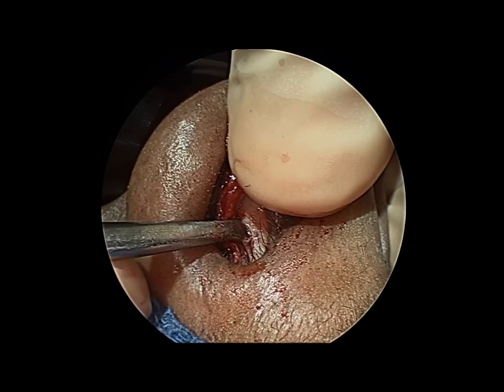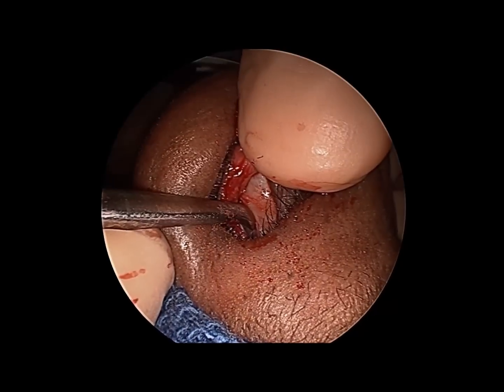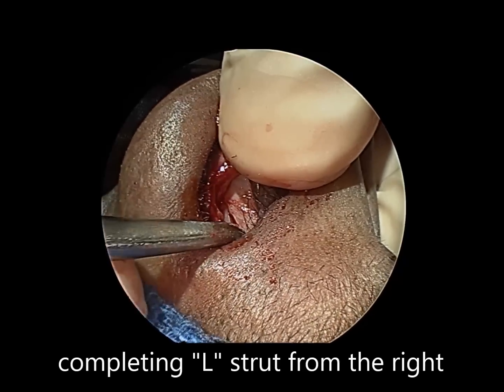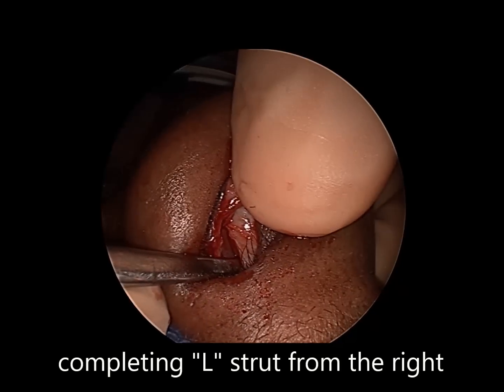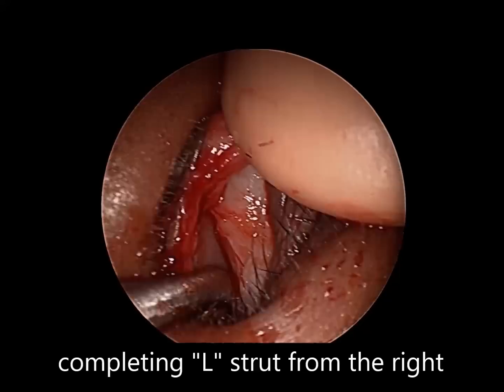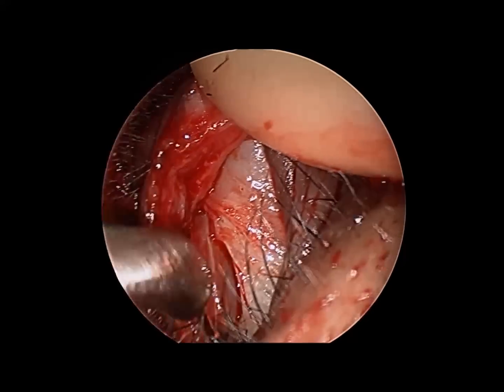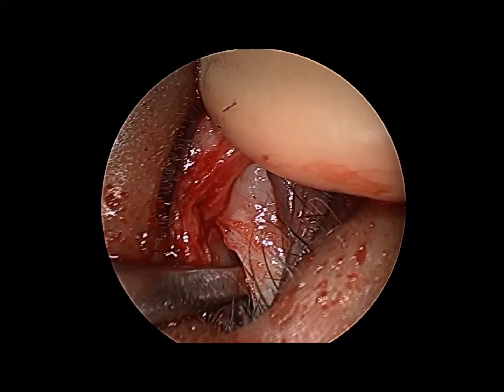In order to elevate the mucosa on the other side of the cartilage from where we have been working, what I often tend to do is flex the anterior cut with my thumb while I utilize instruments to go through the caudal incision that I've made in the cartilage, and this tends to allow us to enter into a nice plane so that we do not disturb and go through the mucosa on the opposite side of where we have been working.